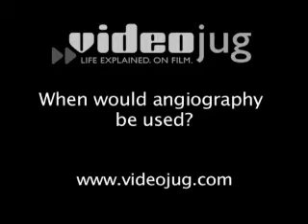When would angiography be used? Angiography is used to look at blood vessels to see whether or not there are areas that are narrowed or blocked or enlarged. It is also useful in looking at the blood vessels of various organs that might be diseased, whether they be involved with a cancer or an infectious process.